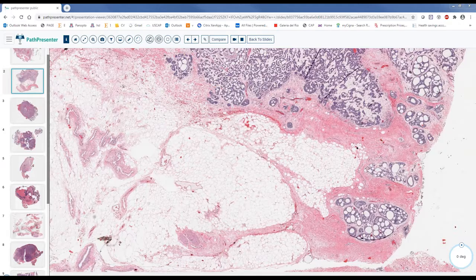It gives metastasis to a lymph node inside the salivary gland, and this lymph node is expanded and outgrown by the squamous cell carcinoma, growing outside the lymph node into the fat, so you really don't see the lymph node anymore.